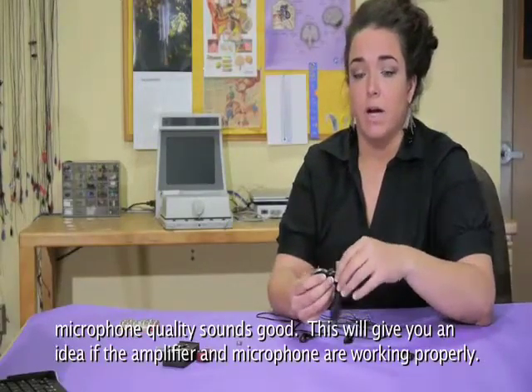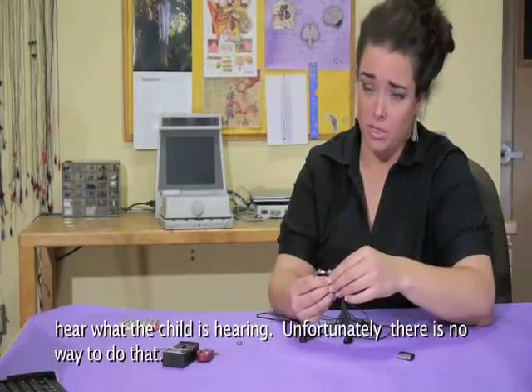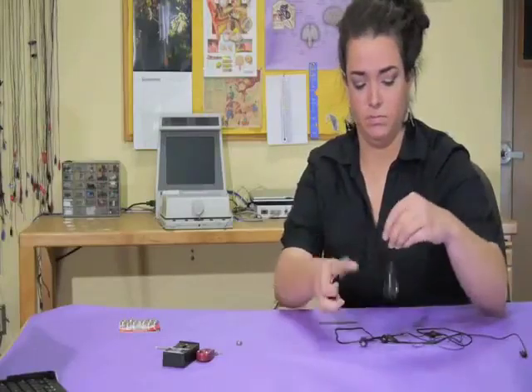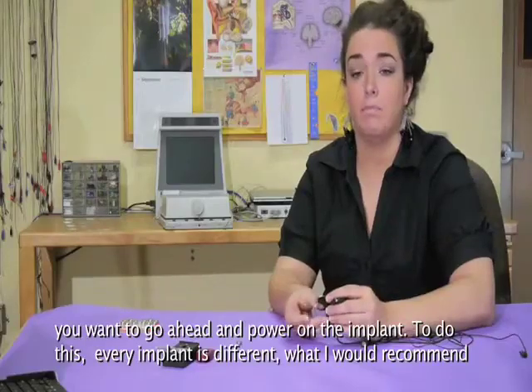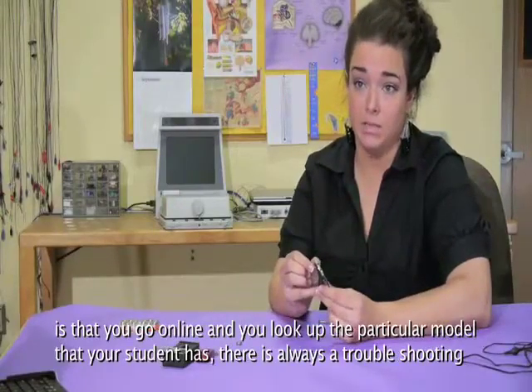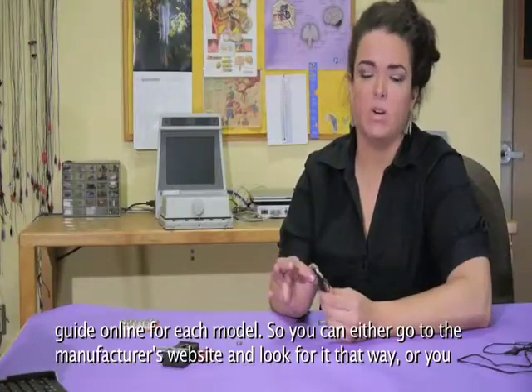This will give you an idea if the amplifier and microphone are working appropriately. Unfortunately, you won't be able to check the quality of the signal that the child is receiving or hear what the child is hearing — there's no way to do that. Once you've determined that all those components are working, power on the implant. Every implant is different, so I would recommend going online and looking up the particular model your student has. There's always a troubleshooting guide online, and you can go to the manufacturer's website or do a Google search.